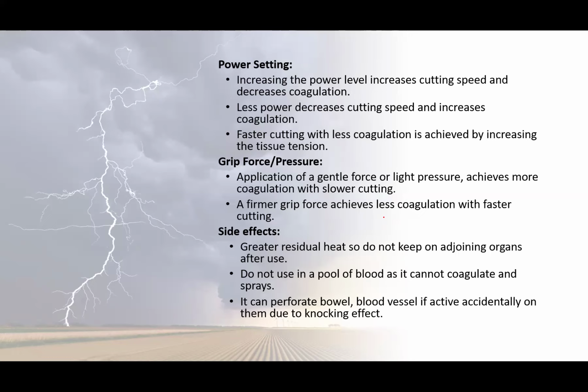What are the side effects? Greater residual heat. At the tip, there will be greater residual heat after the desired effects.